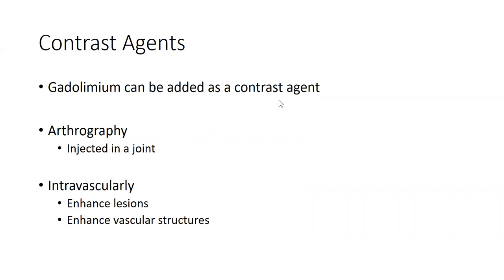For MRIs, we can use gadolinium, which is a more uncommon elemental mineral, and this is safely eliminated by the body. Okay, there are questions about whether it can cause toxicity. Most people think no, but they do see it aggregate in some of the central nuclei of the brain. People don't know the long-term consequences of that.